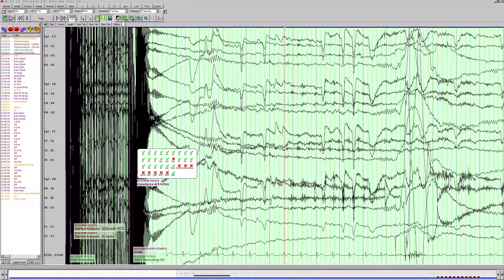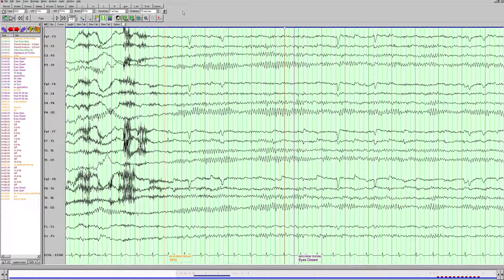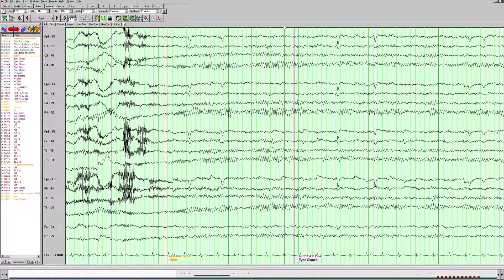As we start going through this EEG, the first thing we want to look at is the background activity and the features we talked about in the first video. When we count up the background frequency here, it's about 10 hertz. A little trick you can do: this is one second, and this green grid line — between here and here — that's 0.2 seconds. So if you count the number of waves in that area and multiply by 5, that'll give you the background frequency. So 2 times 5 equals 10. Our background frequency is 10 hertz, and that's normal.